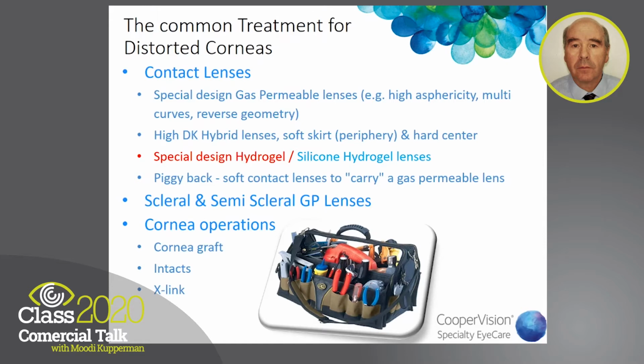Then we have scleral and semi-scleral GP lenses, and there are some corneal operations like corneal graft, like intacs, like crosslink, but most of the operations stop or delay the keratoconus, and we have to put a contact lens solution in order to improve vision for the patient.